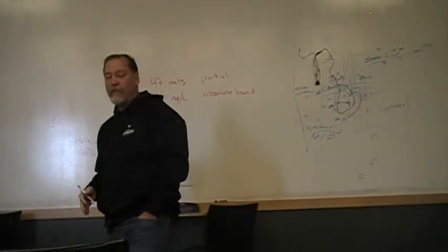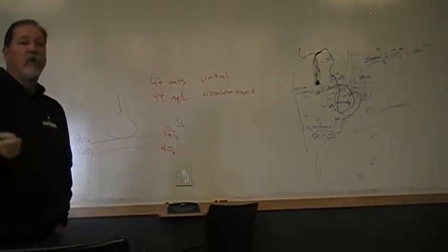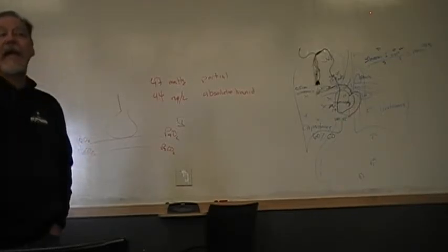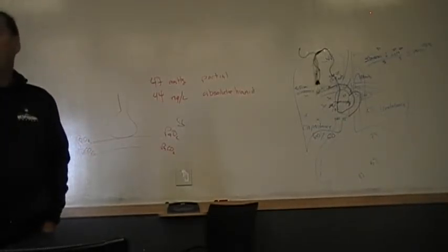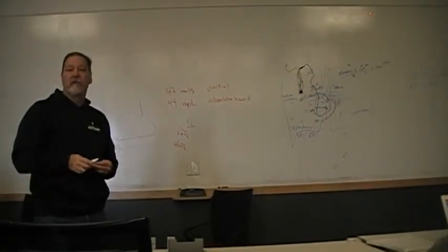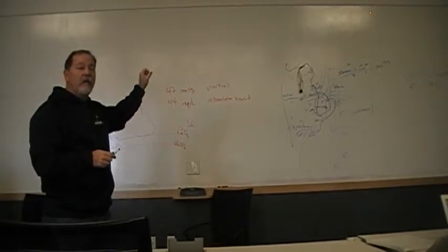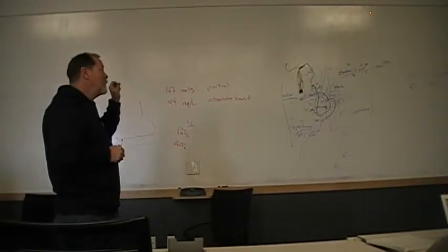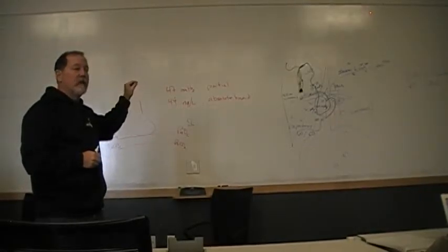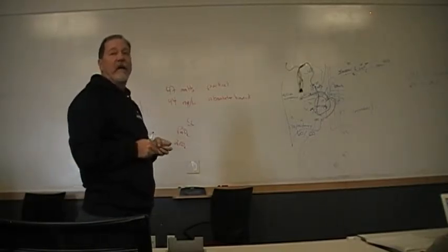So it functions on the assumption that if there's no flow, there's no resistance, and if there's no resistance, then the pressure at the tip of the catheter is the same, leading to the left atrium, through all the miles of vasculature in the pulmonary system, okay? So the balloon is inflated, there's no flow distal to the balloon. If there's no flow, there's zero resistance, and if there's no resistance, then we can make assumptions about what the pressure is back in the left atrium.